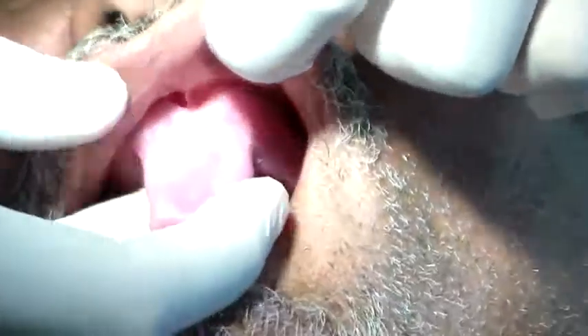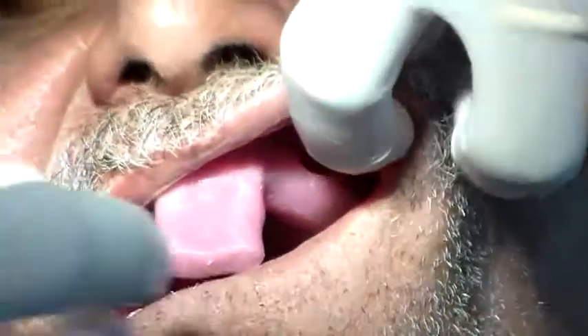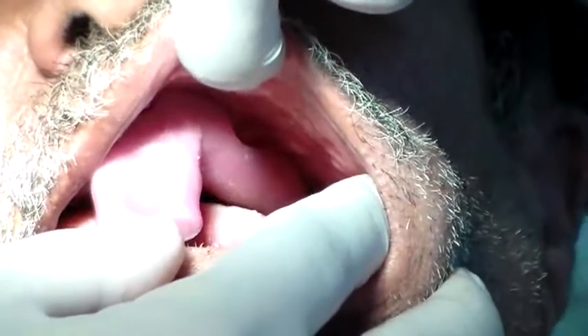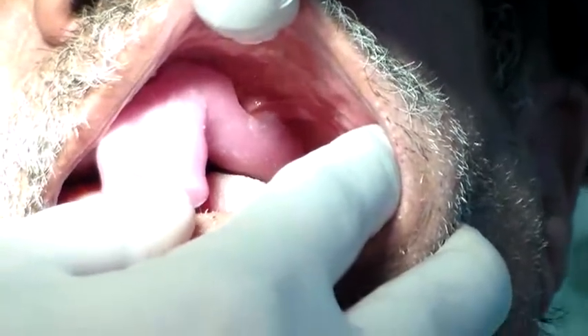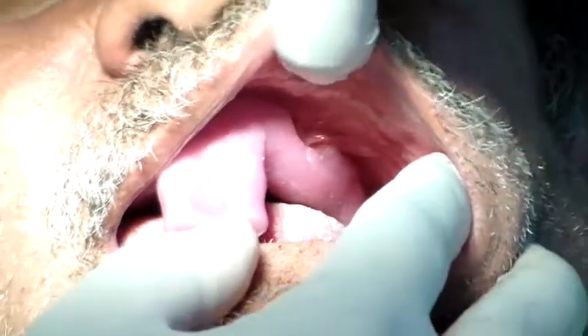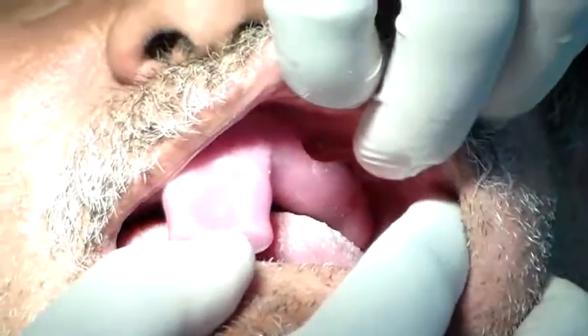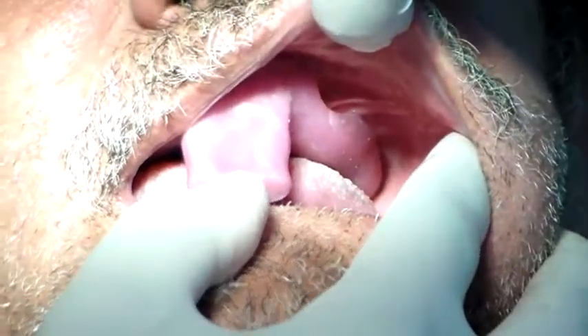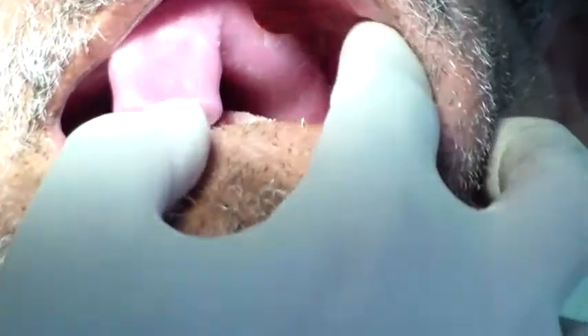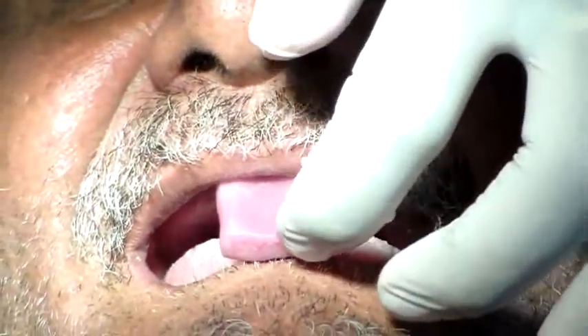Place your tray and then holding the cheek out like that, you want to see if there is space between the tray and the tissue. I can see my buccal phrenum is open, but as I see the posterior part of my tray is really just there. I may need to reduce a little bit there. So I'm going to get a pencil and mark it now.